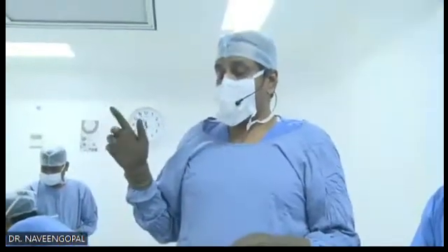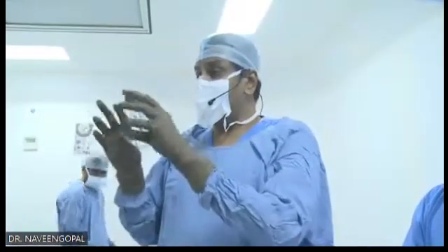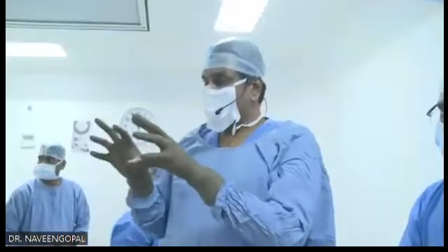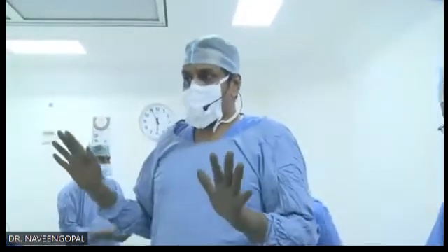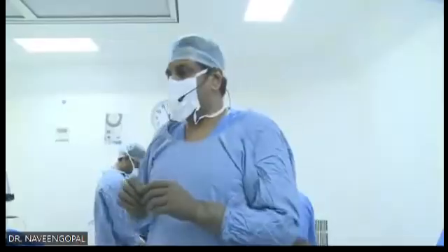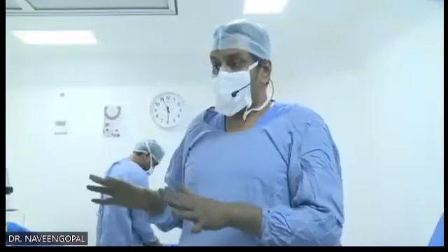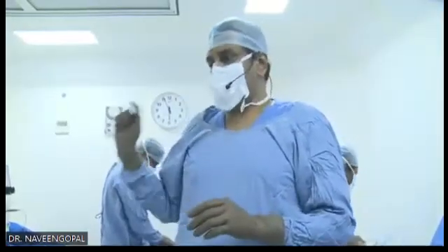apart from white to white and ACD, you need to see the pupil diameter also. Please don't put an ICL if the pupil diameter is above 5, because they end up with glare, especially in night driving. So be careful about your mesopic pupil size.